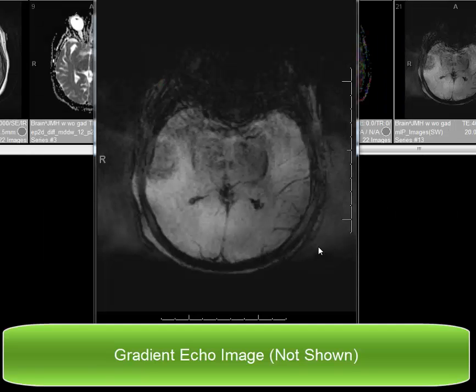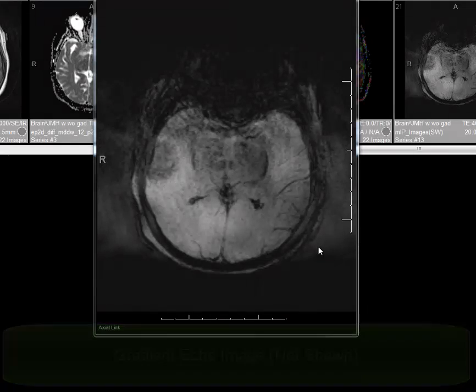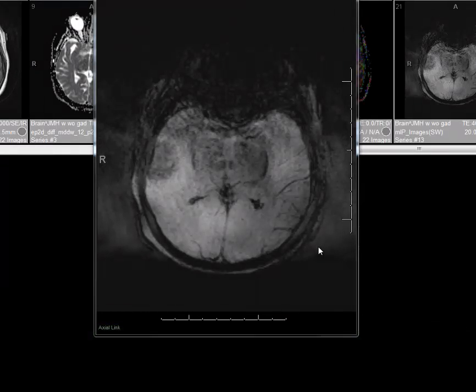I'd like to mention a word about gradient echo sequences. These are acquired with flip angles that are less than 90 degrees. They are more susceptible to magnetic field inhomogeneity, and paramagnetic substances such as blood products, iron, calcification, and manganese deposition are seen more readily with gradient echo sequences.